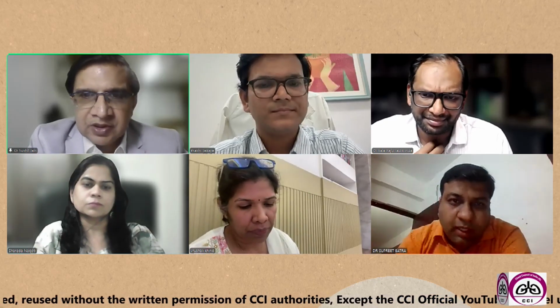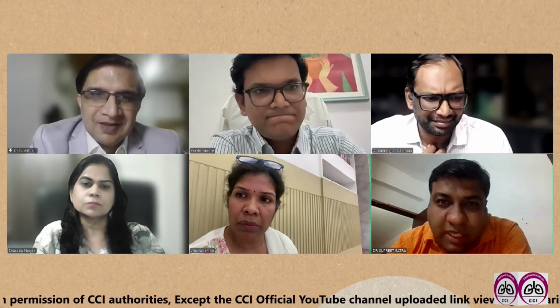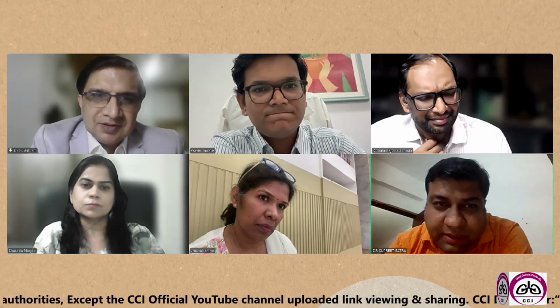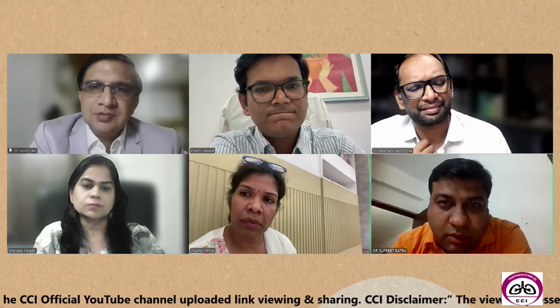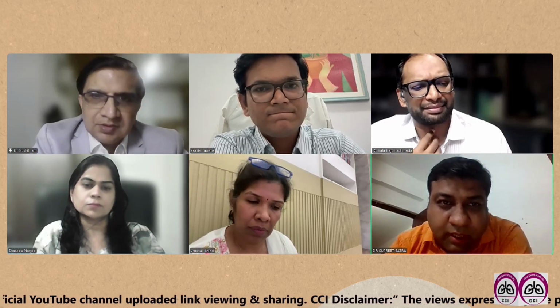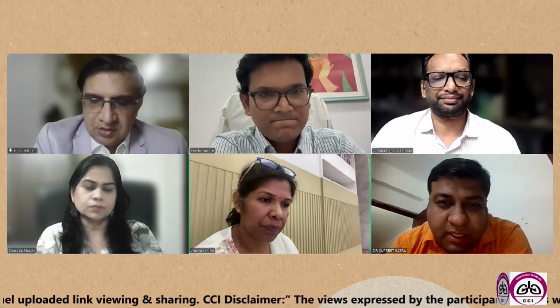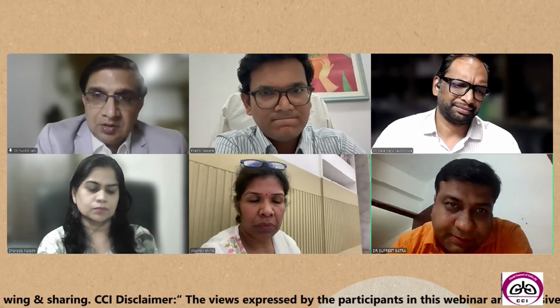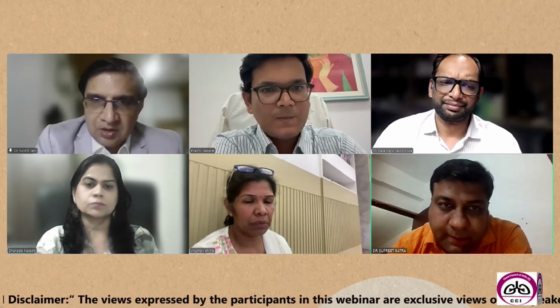Yes, Dr. Supreet, want to say something? Sir, the latest ACCP guidelines say that we should avoid the word core now, because it's not a core, actually, it's an aspiration. That is one thing. Second thing is, if you are taking passes and you see it's a malignancy, you have to take an additional 2 passes. So you have to make it 6 passes now, for molecular testing and for the other cell block. So even if you get a good sample, the guidelines say you must take 6 passes. Okay, so for molecular testing for malignancy. Thank you.